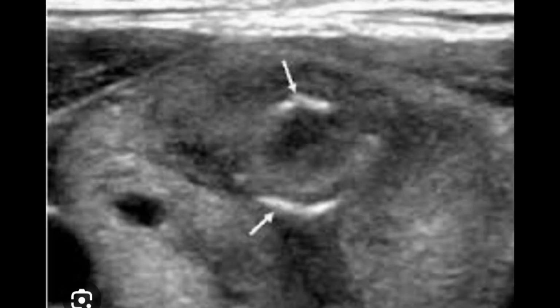So you have seen the surrounding hypoechoic halo, you have seen cystic changes with ring-down artifacts. You have also seen a very particular and characteristic appearance of benignity called spongiform appearance. I have shown you multiple slides for that. Now this is another characteristic feature for the benign nodule, that is peripheral eggshell calcification, which is quite clear on this scan. This is another characteristic example of peripheral eggshell calcification.